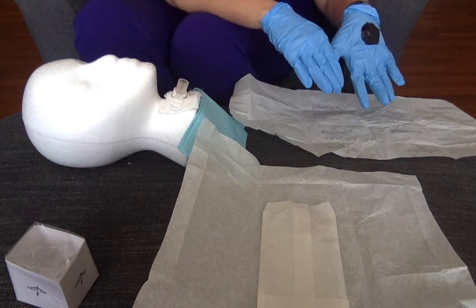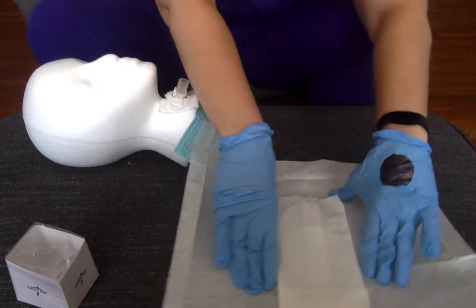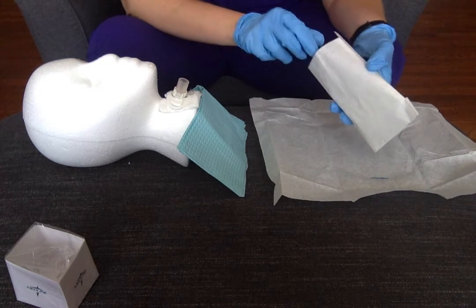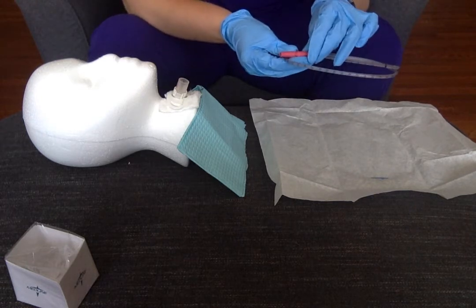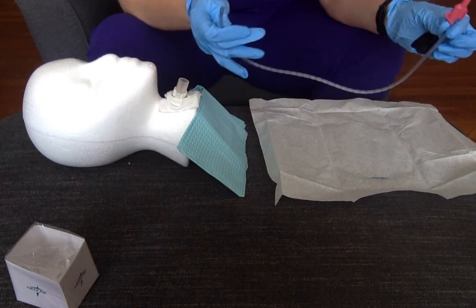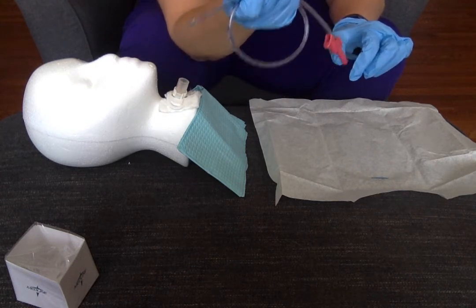When you move the sterile packaging, remember that the outside one-inch border is considered dirty, so you have to grab it from the middle and dispose of it into your trash receptacle. Going back to my sterile catheter — notice I didn't grab the outside of the package. So this is sterile. I'm going to remove my suction catheter. My suction catheter has some little markings for depth. When you get it out, you want to maintain control of this tubing — wrap it around your hand so the tubing won't accidentally bump something that's not sterile.